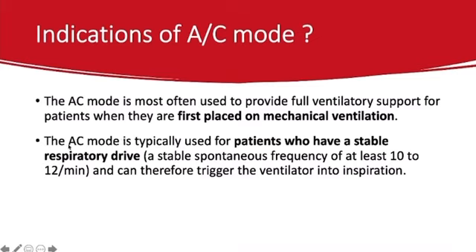The AC mode is typically used for patients who have a stable respiratory drive, a stable spontaneous frequency from 10 to 12. Why do we need this? We need the patient to trigger the ventilator to inspiration. That's why we need a good or stable respiratory drive.